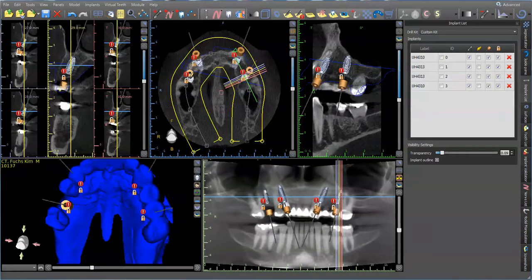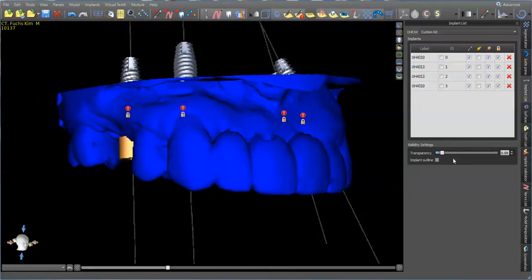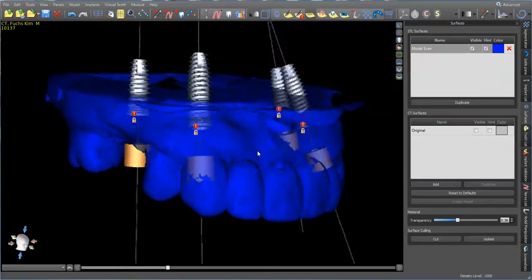So what we'll do is we'll lock all these implants. I changed the tube's diameter to a 2.1. I need the tubes to show when I'm making the cuts. We're just going to work in this profile here, keeping this tooth. So what we can do is go into surfaces, click on model scan, change the transparency a little bit so I can start seeing where the guide teeth stick out. And I'm going to go ahead and start making my cuts.